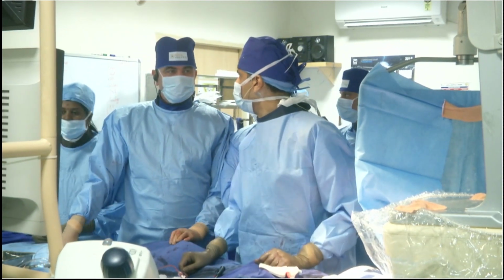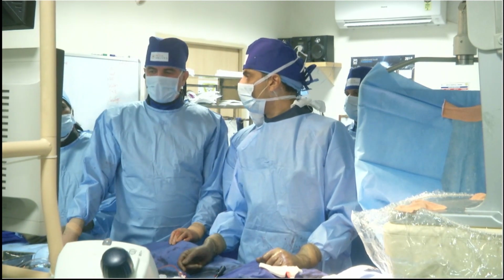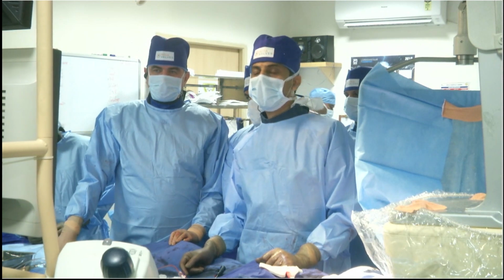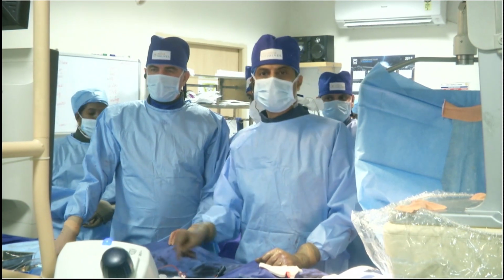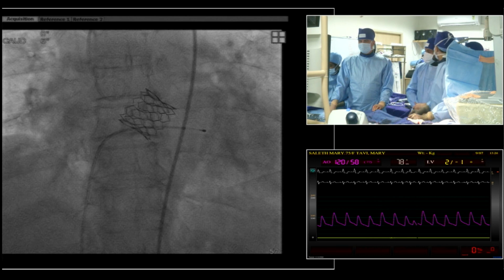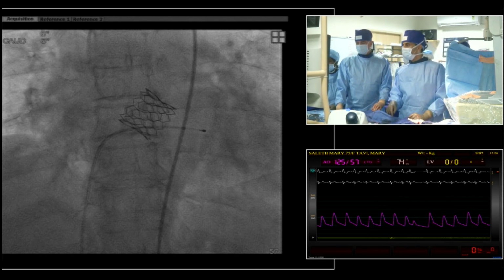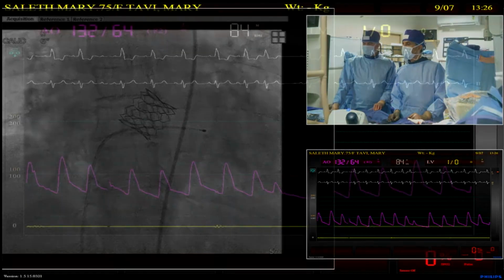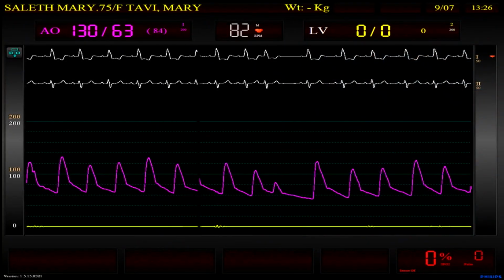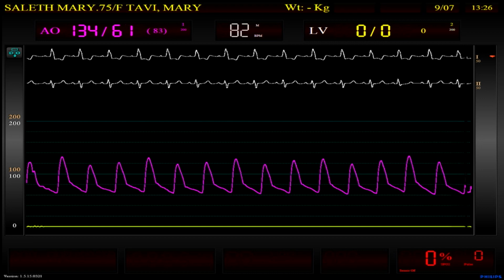And by the way, none of you should start believing that you've got to do minimalist TAVR right from the beginning. You've got to do a safe TAVR from the beginning. You're not in a rush to send the patient home and boast that I sent him in 2 days' time and I didn't put anything in. You'd rather have a patient for 5 days who's spent so much money, provided he goes home fine and alive. You will get to that stage when you'll send your selective patients home in 2 days' time. But you don't have to start believing that that's the way to do TAVR in your first 10 patients.